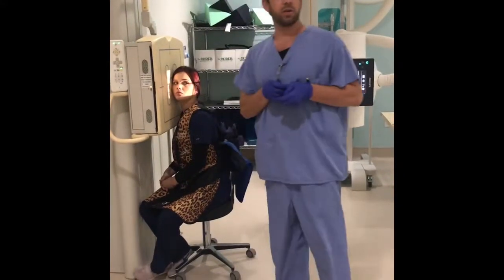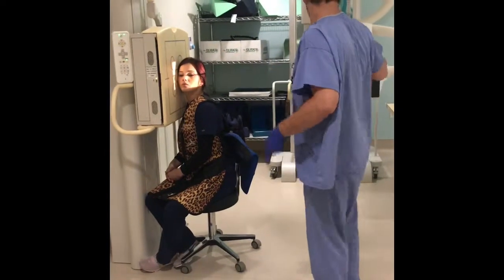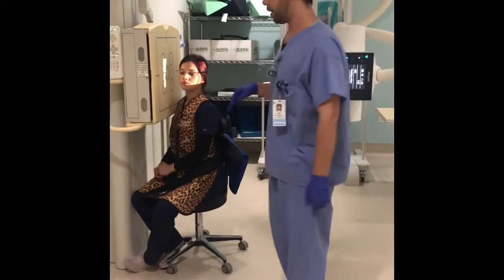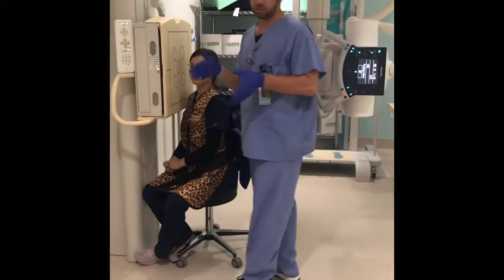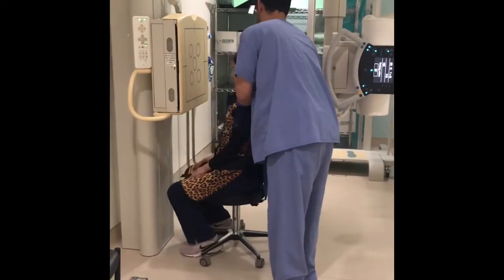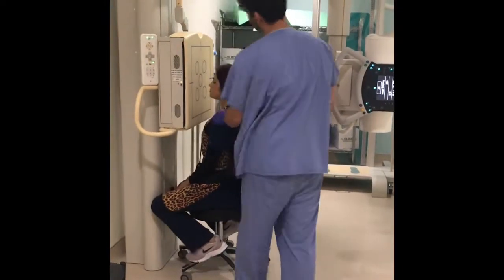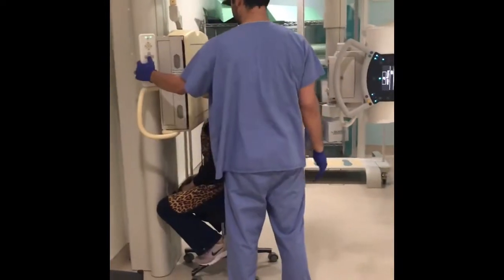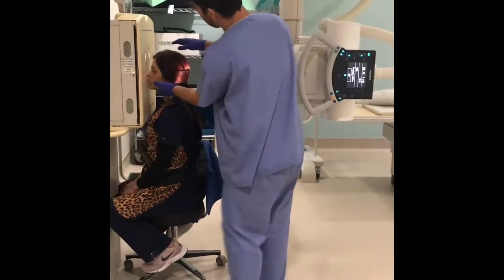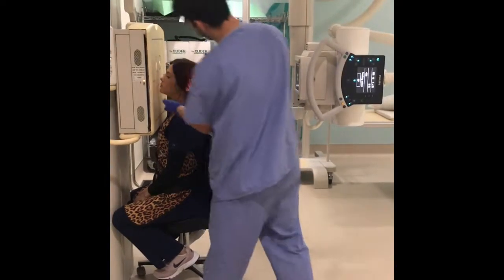So for the next one, I'm going to do a PA Caldwell, and normally a PA Caldwell has a 15-degree angle, but since we have to keep our CR completely horizontal for air fluid levels, we're going to use the head to position. All right, so if you'd like to scoot back slightly, and now we're going to scoot you forward slightly and put your nose against the center of the IR. Perfect. And now we're going to use her head to position almost a 15-degree angle.